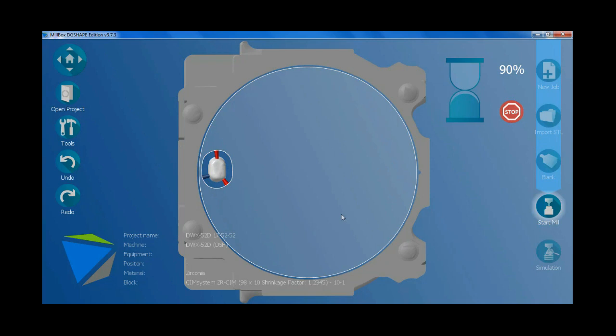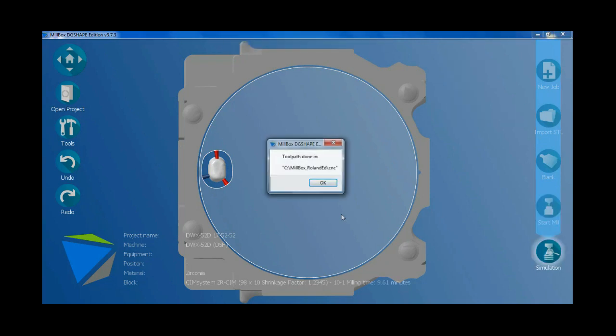I wait for the calculation to be finished. Yes, click OK. The calculation is done. The crown is now ready to mill.